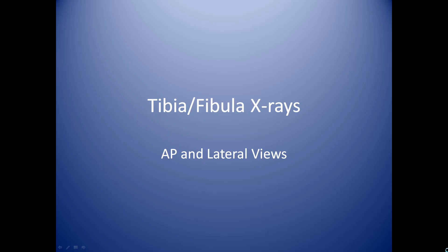In this module, we'll review tibia fibula x-rays. This is the lower leg. We'll cover AP and lateral views.